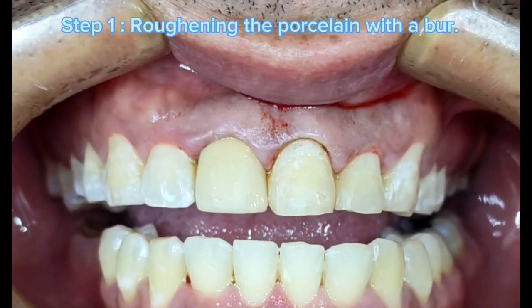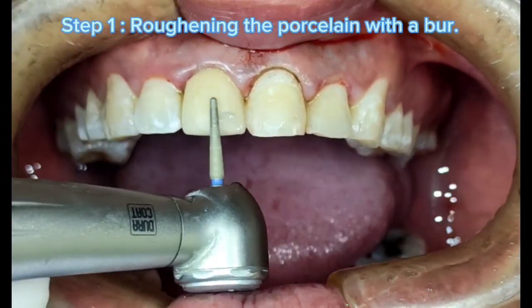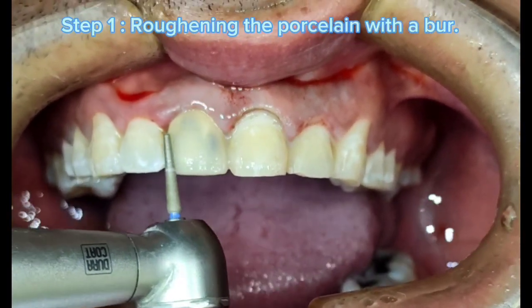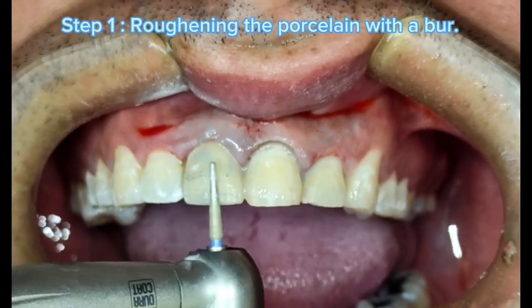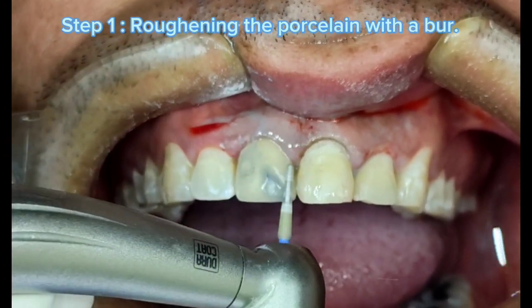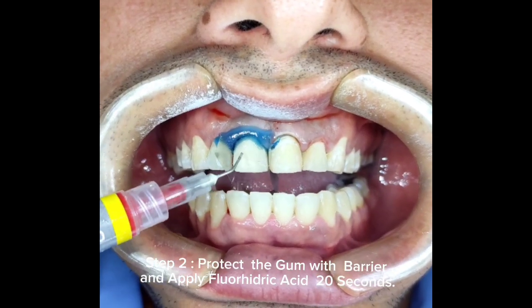The patient has a crown on the upper right central, but the other teeth have veneers. We are going to do composite veneers. The first step is to roughen the surface of the porcelain with a high speed burr. You can use the black or the blue color, a coarse burr, to remove the shine of the porcelain crown and to get better retention over the porcelain.